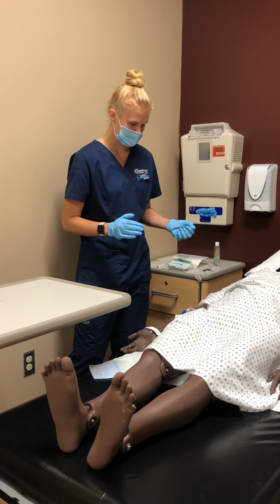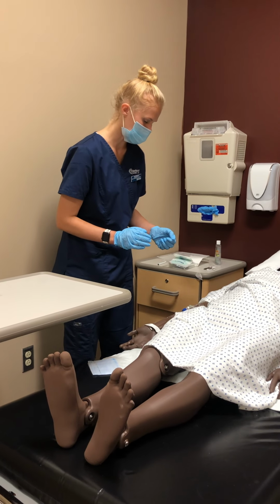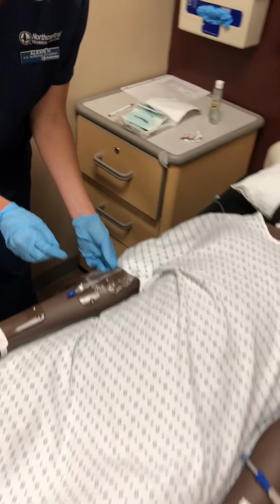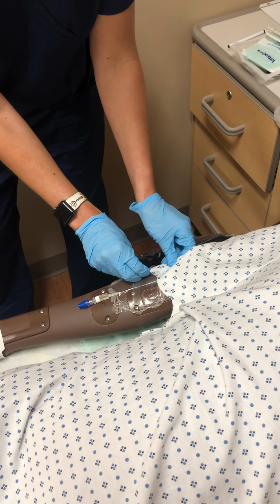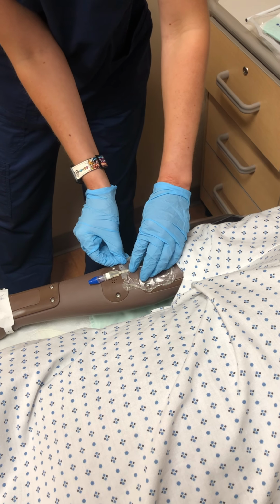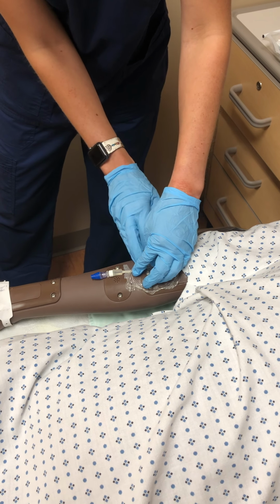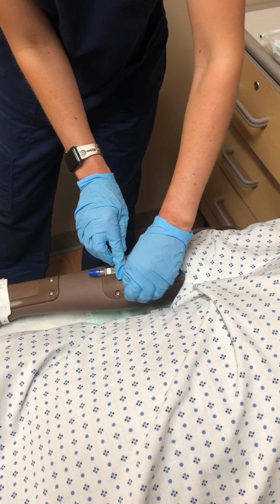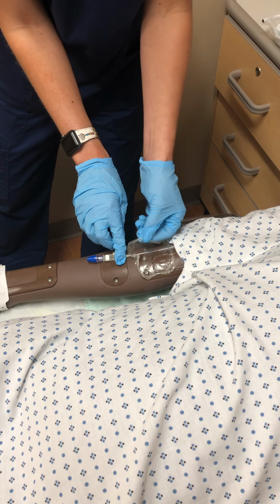So next, I check for drainage. Now what I want to do, without sticking to the patient, is start down here and then go up, so that you don't pull the IV out.